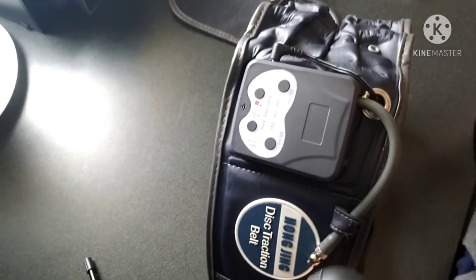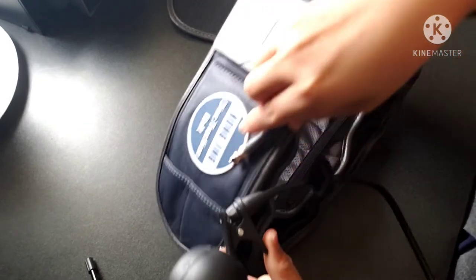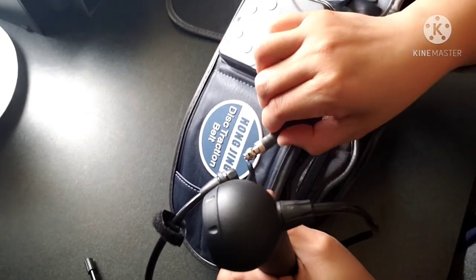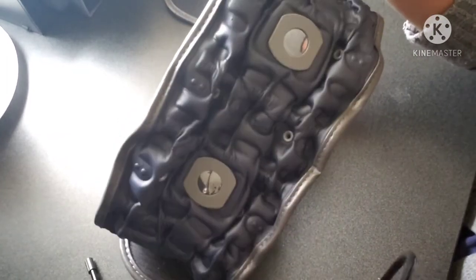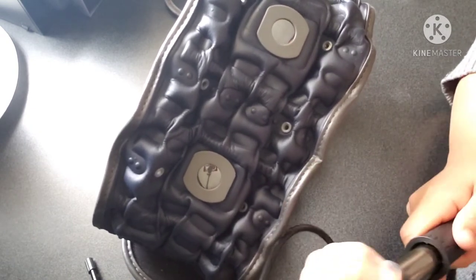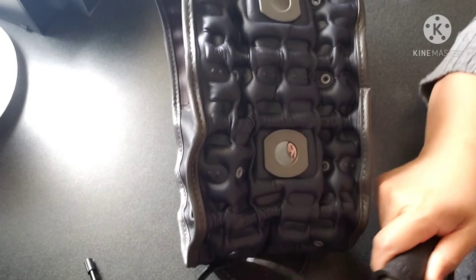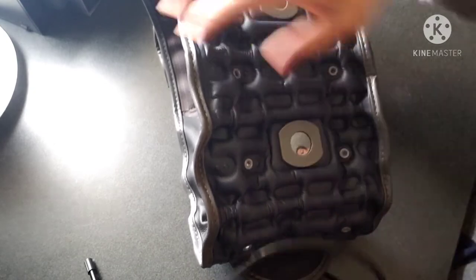What I usually do is mount the pump here, then pump it — and you can see it's going to be expanding. There you go. If you add more air it expands further, and when it's expanded enough you can take the pump off.